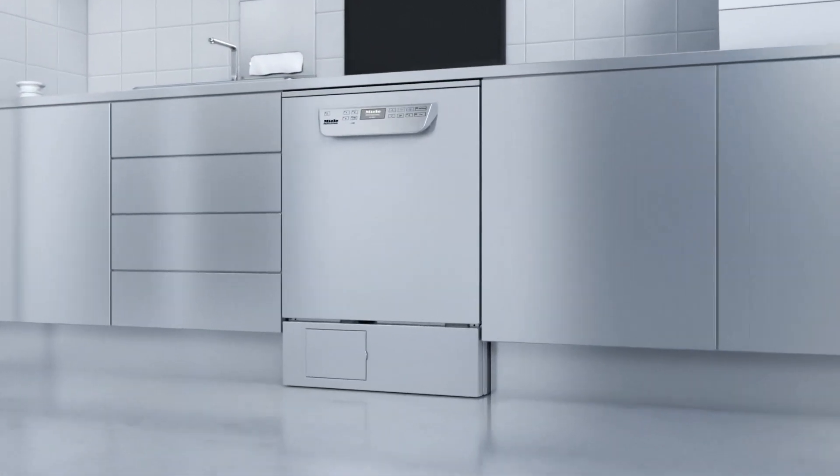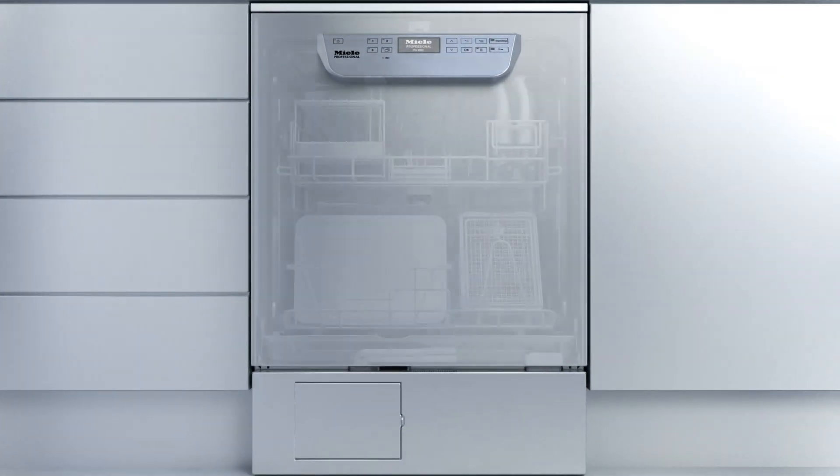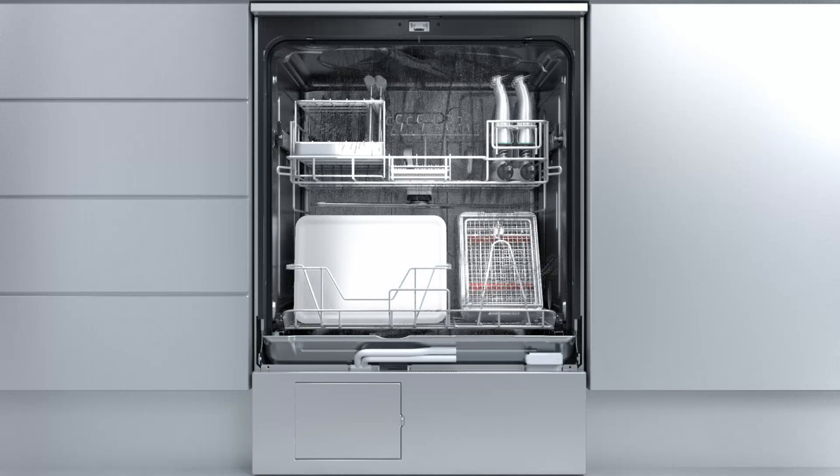Washer disinfectors from Miele for enhanced performance. Thanks to new Miele technology, spray pressure and mechanical action are always perfectly aligned with the needs of the current load and program phase.